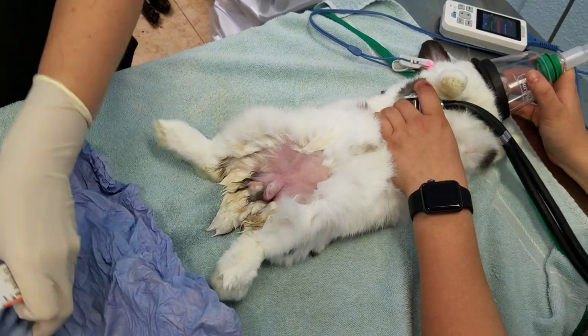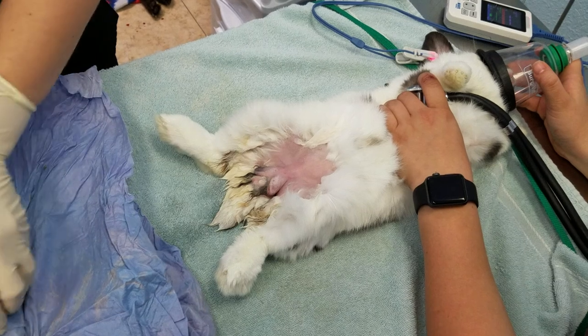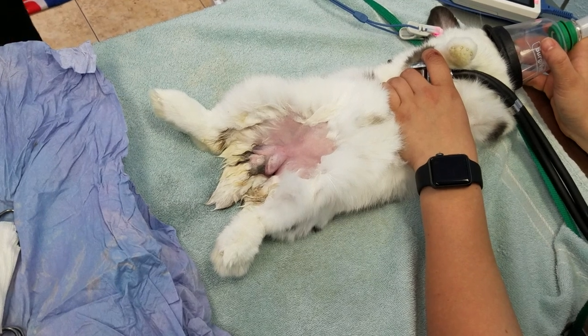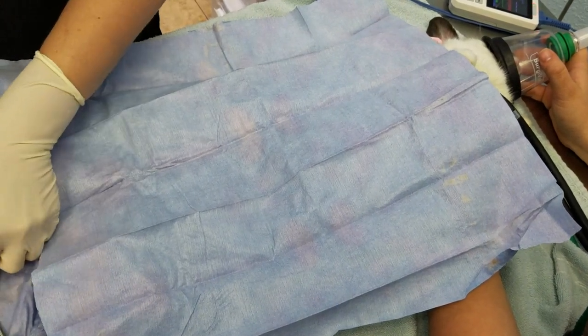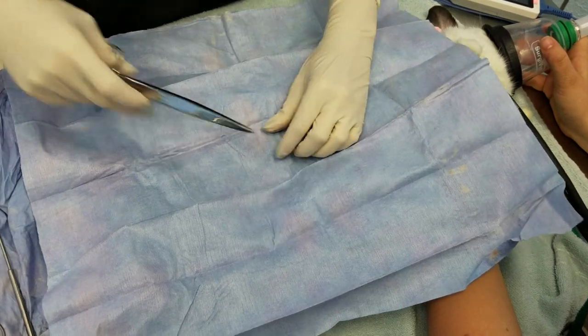Okay, we got a bunny neuter. I tend to do these pre-scrotal. You'll see we have my tech listening to the heart. These guys tend to be a little bit finicky for anesthesia. I have induced him with ketamine midazolam and we're maintaining on ISO.